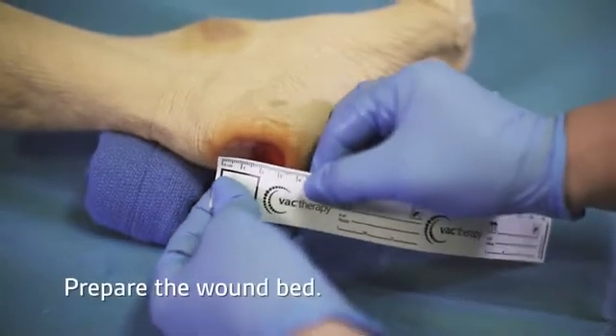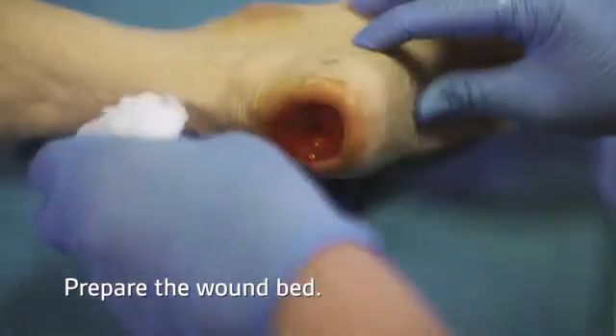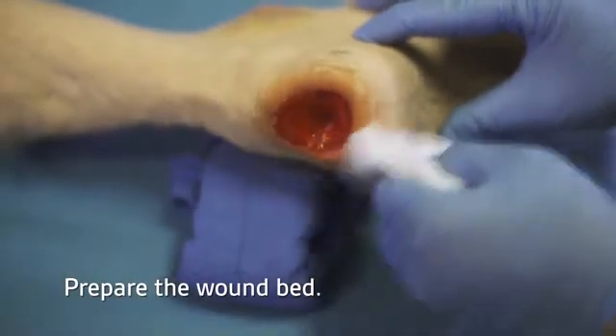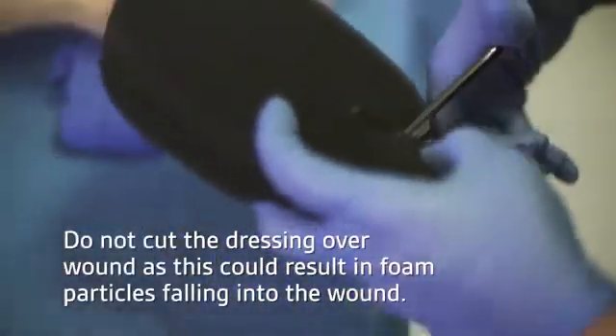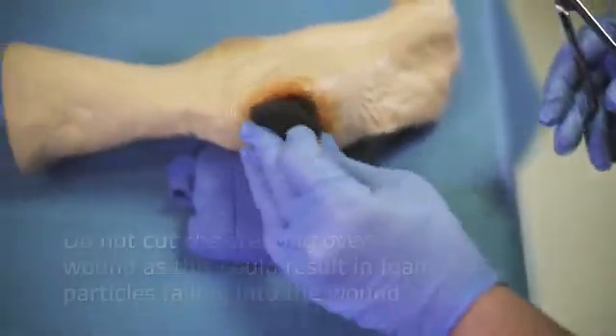Begin by assessing the wound size and type and prepare the wound bed according to institutional protocols. Next, cut the dressing to fit the size and shape of the wound. Make sure it's not placed over intact skin.